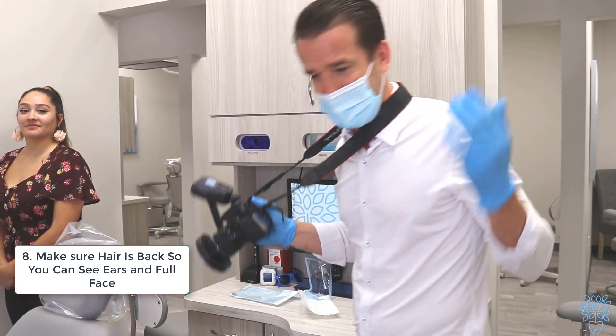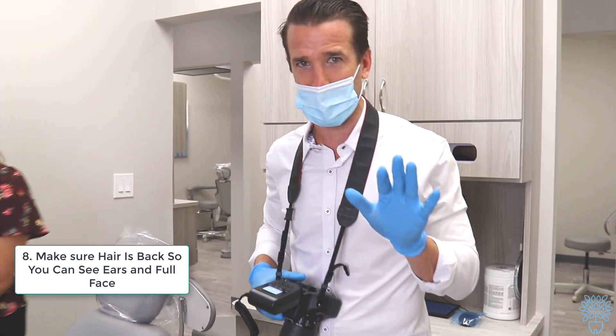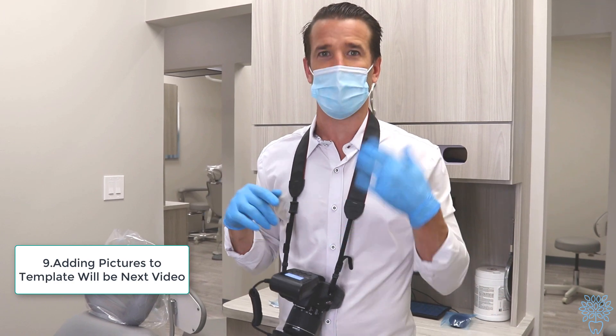That's taking orthodontic pictures — five pictures inside the mouth and three pictures outside the mouth. Now we're going to show you how to enter them into the template to finalize the project. That's it for video number two; in video number three, we'll go over how to put these pictures into the computer and exactly where we want them.